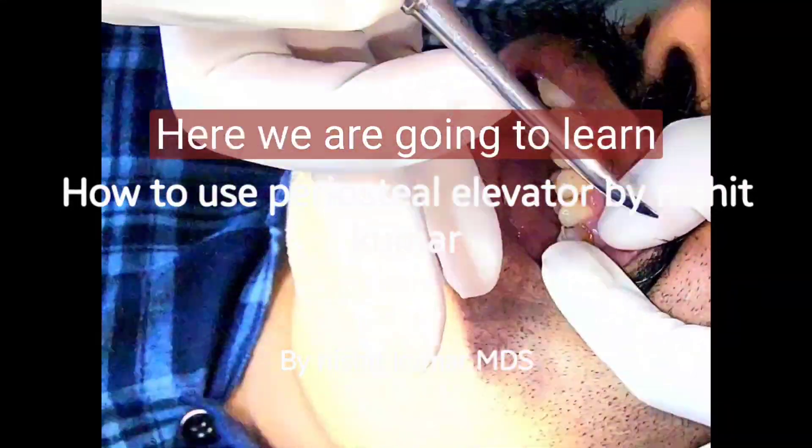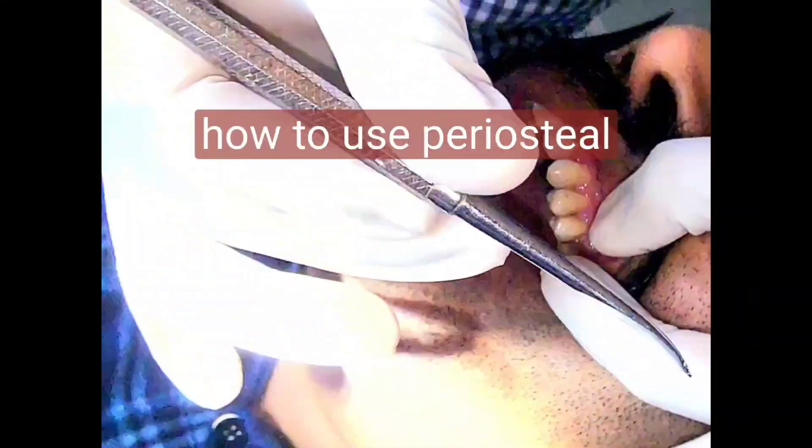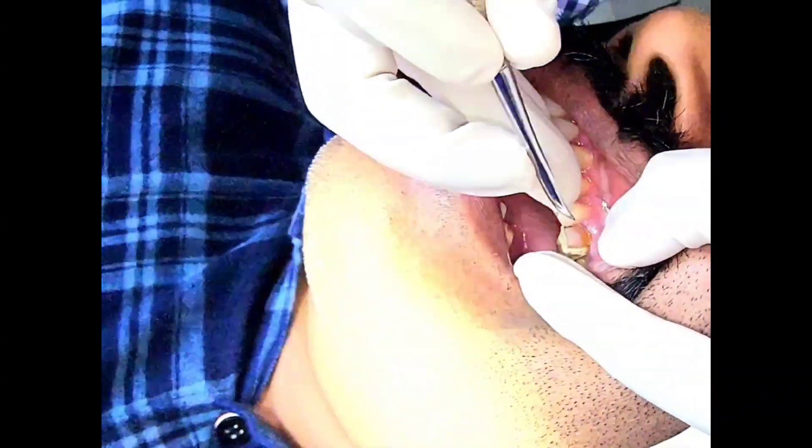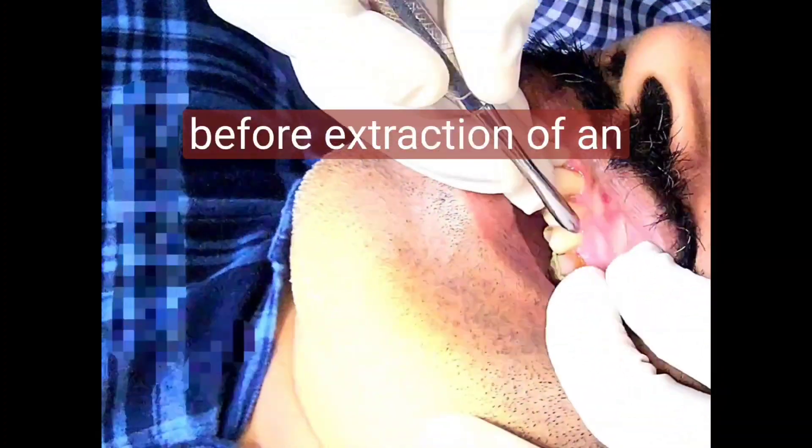Here we are going to learn how to use a periosteal elevator to reflect the mucoperiosteum before extraction of a tooth.